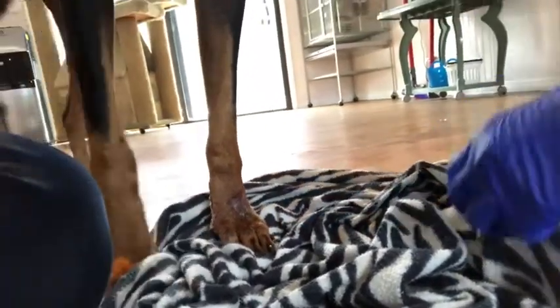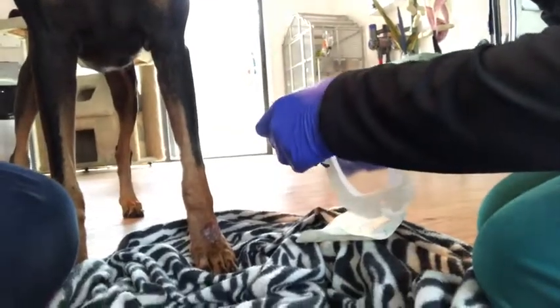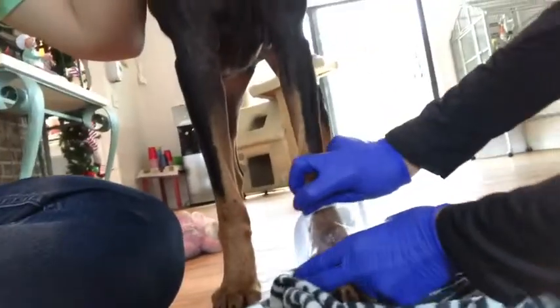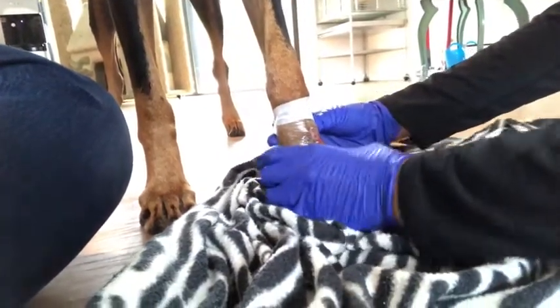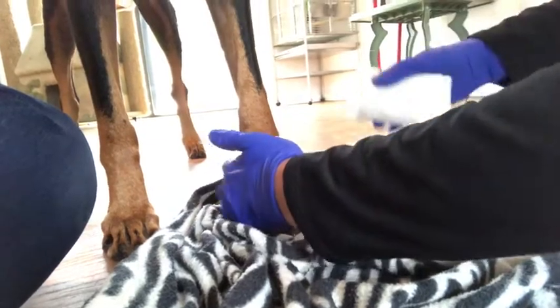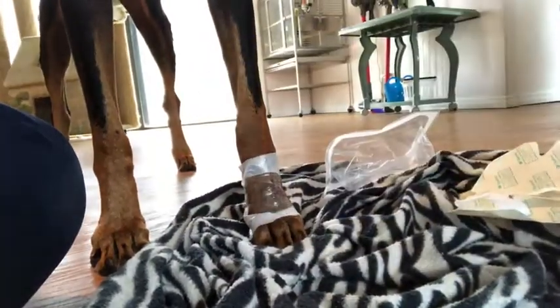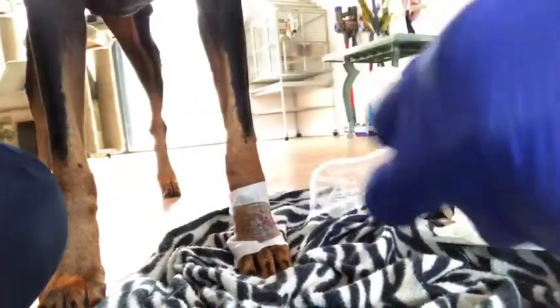What I'm doing today you guys will not be doing at home, but I'll show you. This is called Tegaderm — it's like a second layer of skin. It's really hard to get stuff to stick to fur, so we're going to try our best. This is not usually ideal for hot spots because it's not going to let it breathe, but we're going to do this for one day and see if we can kickstart healing a little bit more.